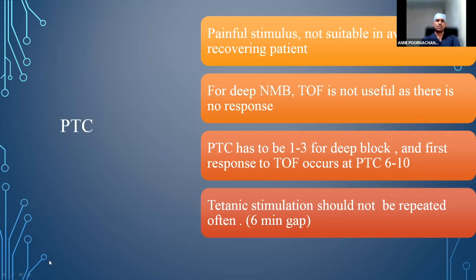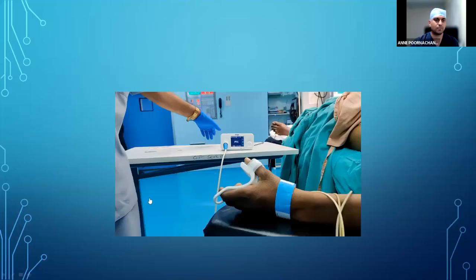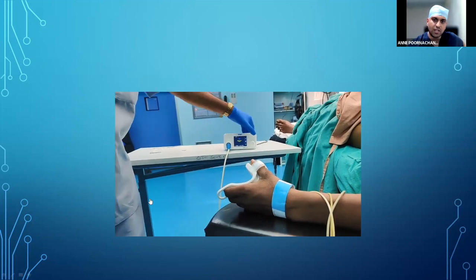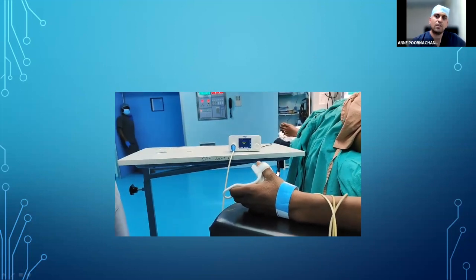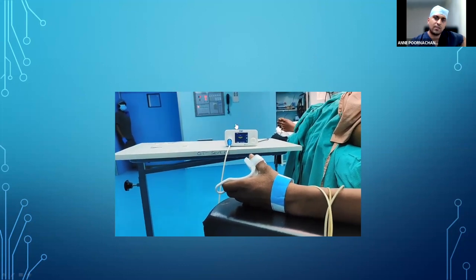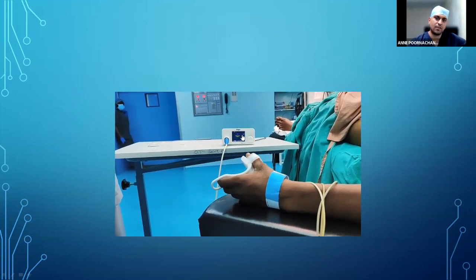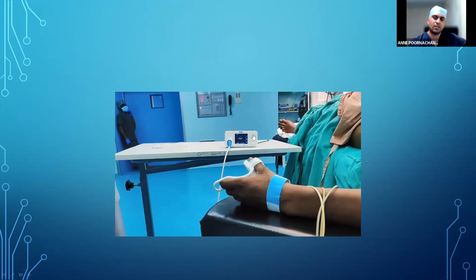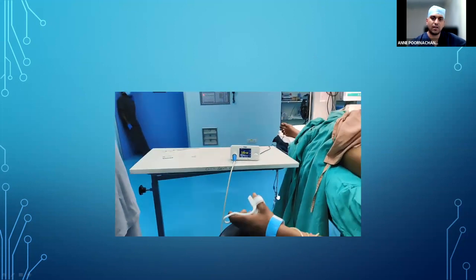Post-tetanic count. This is a painful stimulus. A tetanic stimulus is given followed by single twitch stimuli. This particular stimulus pattern is useful for assessing deeper levels of neuromuscular block. I'll show a small clip on PTC. First, a tetanic stimulus is delivered to the patient at 50 Hz. You can see sustained contraction of the muscle, followed by a 3-second gap. Then we give single twitches at 1 Hz frequency. Between 10 and 20 stimuli are given, depending on the machine. This particular machine delivered 10 stimuli and all 10 responses were recorded.